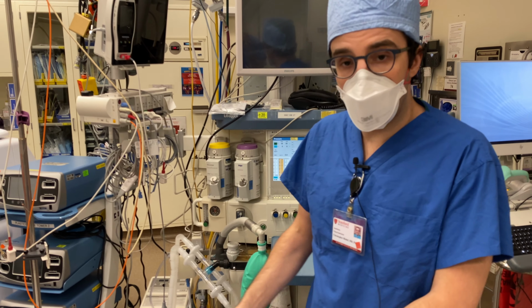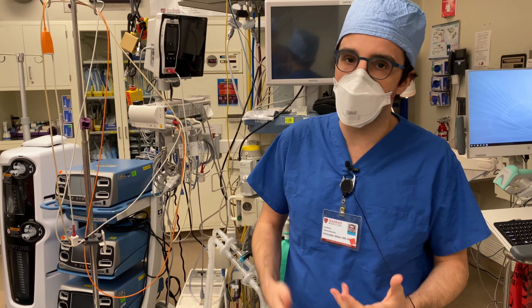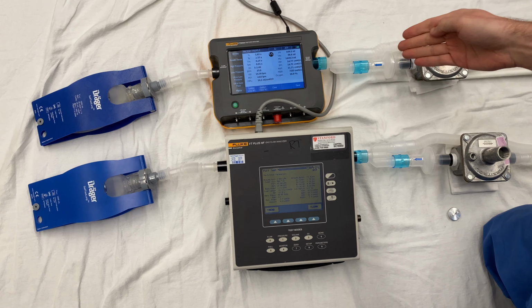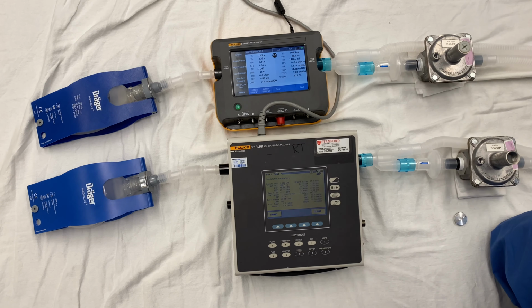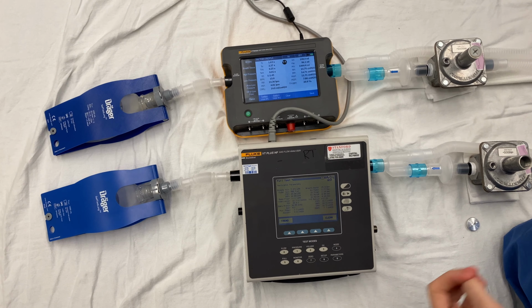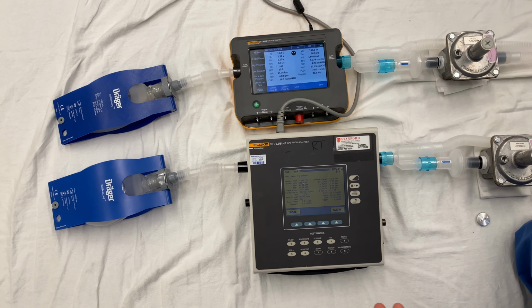So now I'll show you actually moving through each of the patients individually and show how you can make adjustments to independently control the tidal volumes and pressures that you're delivering to each of these patients. So if you look down here, we see information about how we're ventilating each of these simulated patients. And right now I have these set to fairly extreme settings, not even necessarily a clinically realistic ventilation, but showing that if we can do this, then actually clinically realistic ventilation parameters are very achievable.